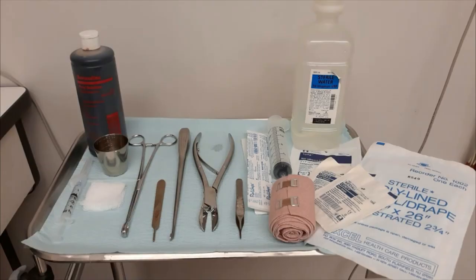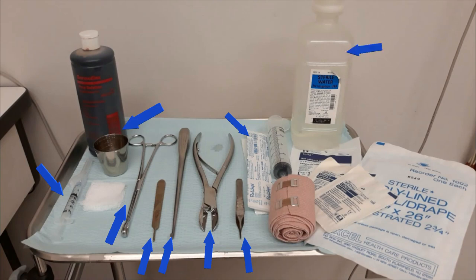For this procedure, our tray setup will include a local anesthetic injection setup with xylocaine, sponge forceps with gauze pads, a sterile cup, a scalpel, a curette, surgical tissue nippers, tissue forceps, cotton tip applicators, sterile water, syringe, non-adherent pad, gauze, bandage wrap, and a fenestrated drape.